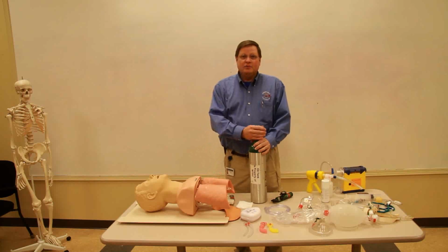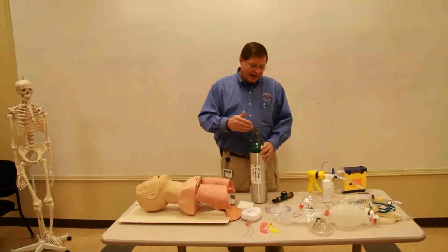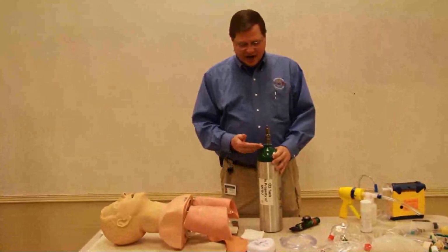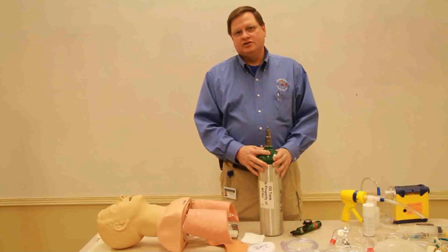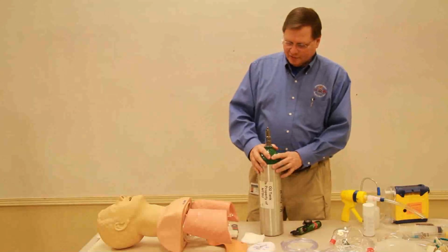My name is Randy White, and I'm going to demonstrate to you oxygen setup. I'm also going to be demonstrating the non-rebreather mask and the nasal cannula too. So in oxygen setup, what we want to remember is that oxygen is not flammable. Oxygen supports combustion, so everything around it will burn hotter, brighter, those types of things. But oxygen itself is not flammable.